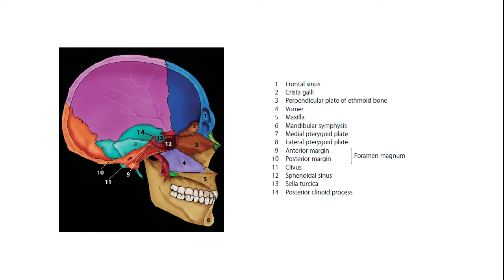accurate and detailed evaluation of the underlying dentoskeletal pattern requires analysis of the lateral and posteroanterior cephalometric radiographs taken in natural head position. In highly complex cases, such as severe craniofacial asymmetries or craniofacial syndromes, three-dimensional imaging is also required.